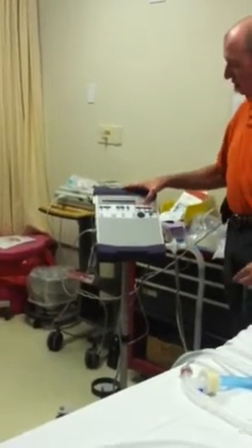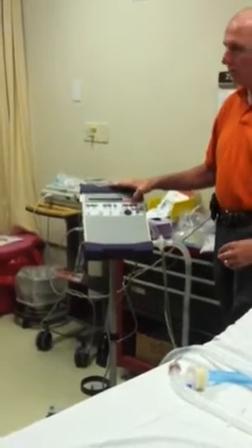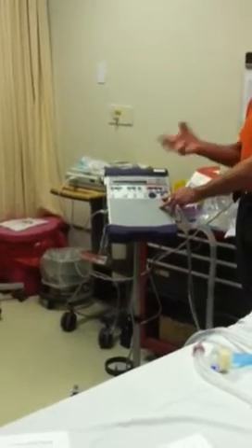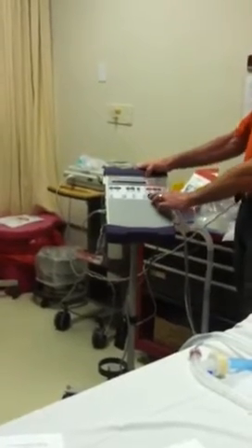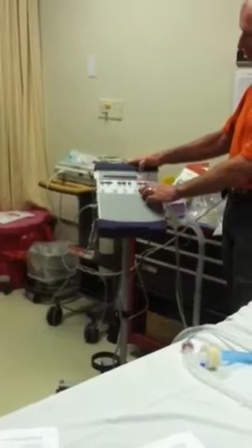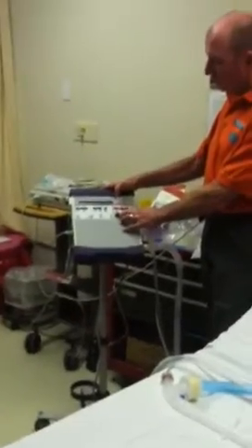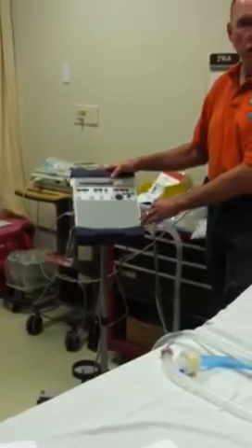Low pressure, we always keep around 5. And that'll sound the alarm enough to let us know if it's disconnected. High pressure, we usually keep at 60, but we can go all the way up to 100. But we normally keep it at 60 because we don't want the pressures in the lungs to get much higher than that for the risk of trauma to the lungs.